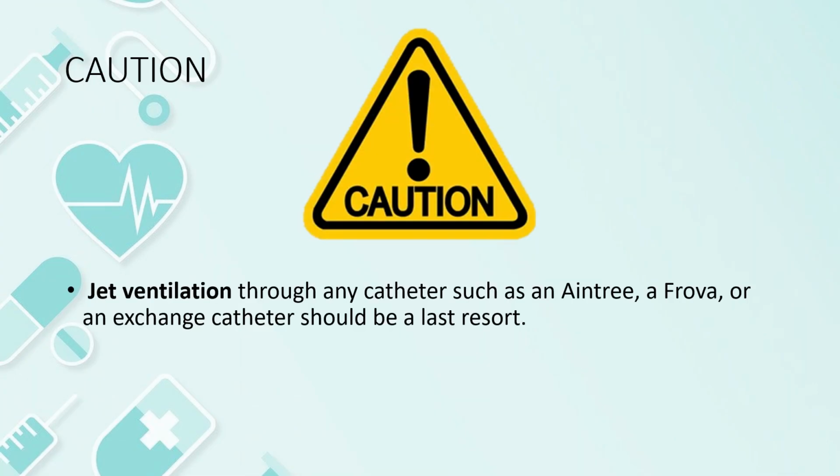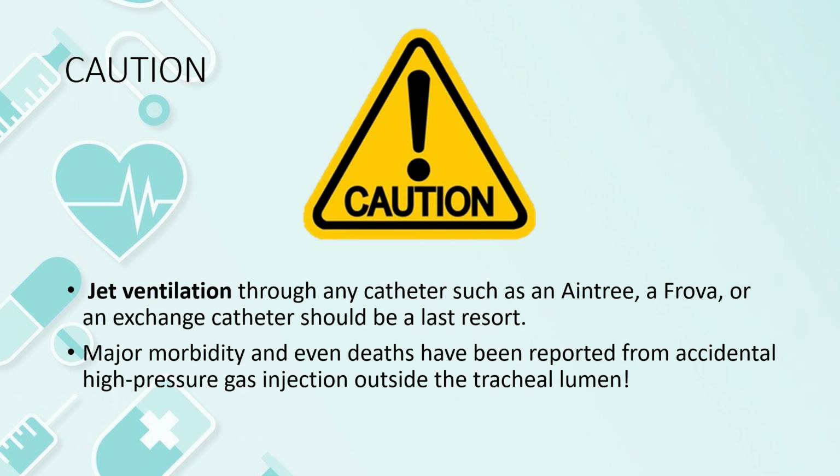Caution: jet ventilation through any catheter, such as the Aintree or a Frova or the exchange catheter, should be the last resort, as major morbidity and even deaths have been reported from accidental high pressure gas injection outside the tracheal lumen.